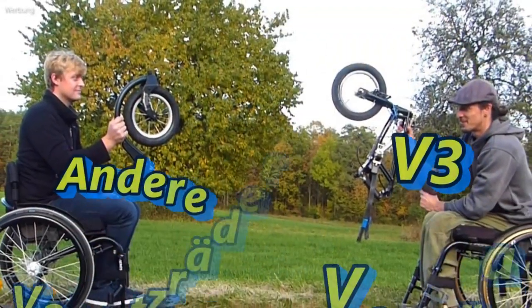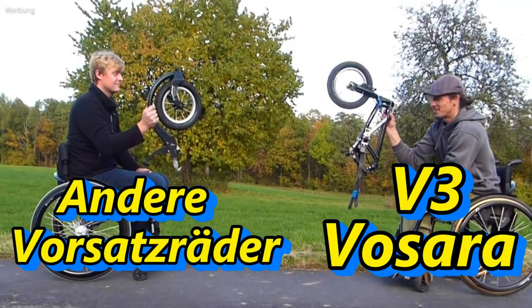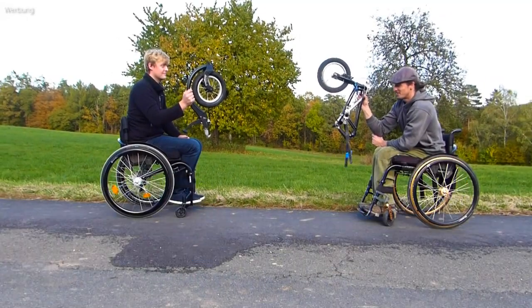Here we've got two front wheels, which are very similar at first glance in terms of size and weight. On closer inspection, however, they are clearly different.